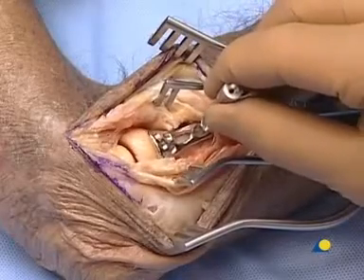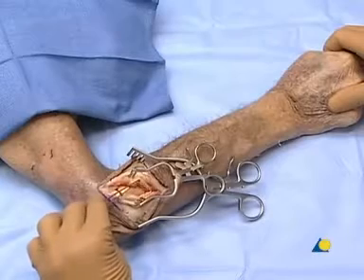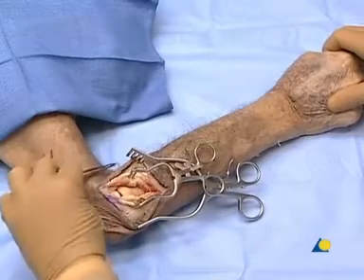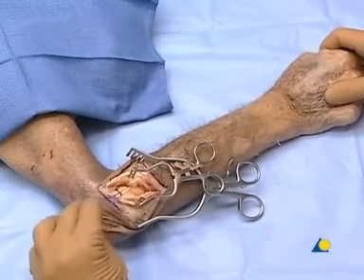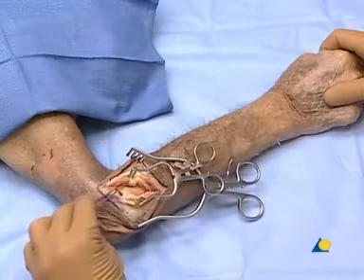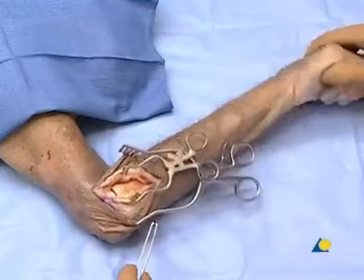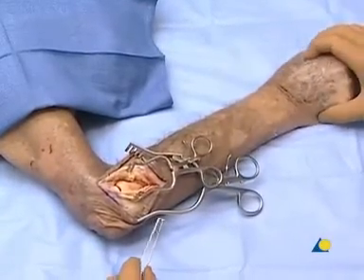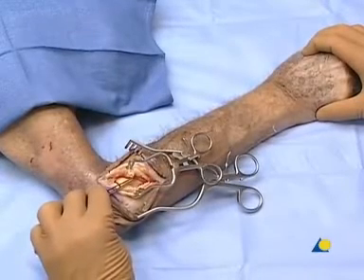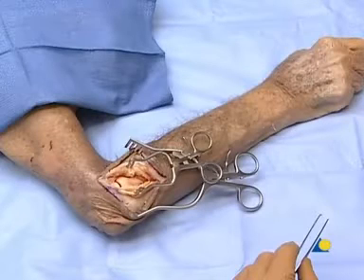The safe zone of the radial head and neck is in the non-articular region. If the plate is placed on the lateral portion, it should not impinge ulnarly on the proximal radial ulnar joint. With the forearm in a neutral position, the center of the safe zone is straight lateral, plus or minus 50 degrees. If the position of the plate is too posterior or too anterior, under rotation it will impinge on the joint in pronation or supination. The plate is placed straight lateral in the safe zone, which subtends an arc of about 100 degrees.